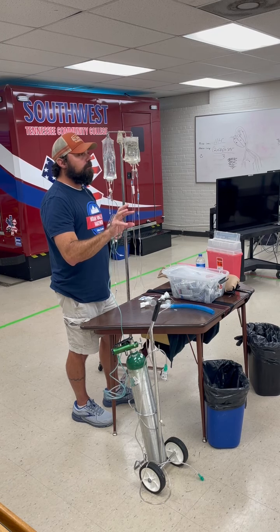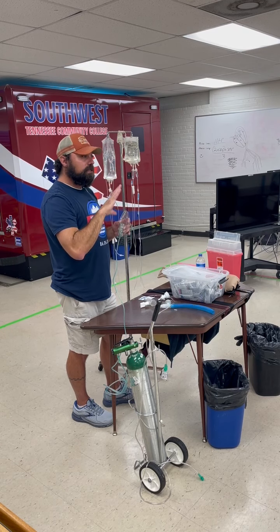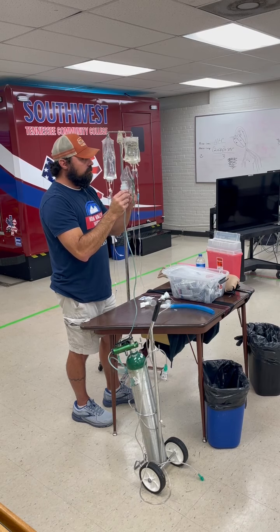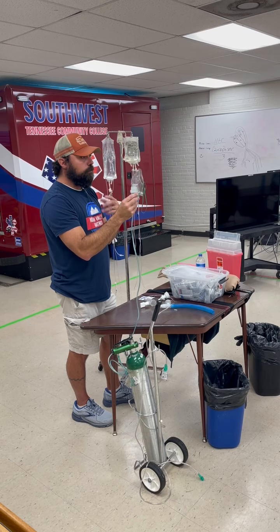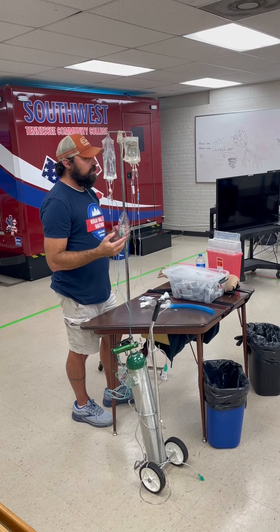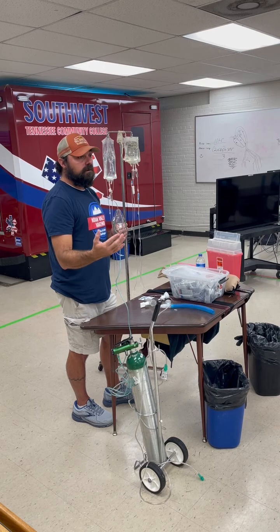So CPAP machines, and we're going to go over that. Actually, Rick's going to teach you that. Some, not all, some CPAP machines actually have a connector for this, so you can hook them up to an albuterol treatment while they're on CPAP. That works really well. Not all of them have that attachment. So ultimately, the medicine itself is fine to give.